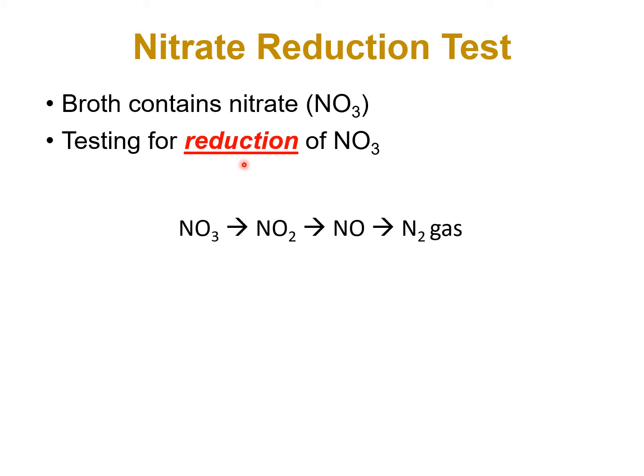Remember the redox reaction one more time. OIL RIG: reduction is gain. So we want to know whether the nitrate is going to accept electrons.